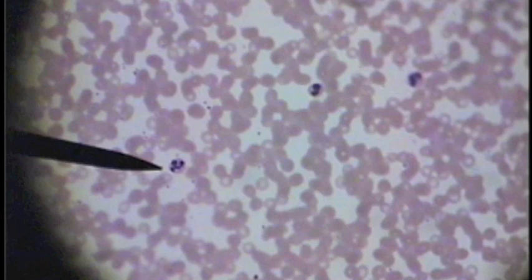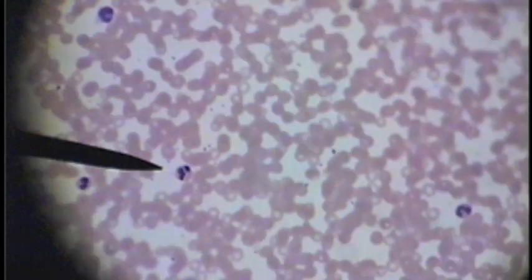You can also see three white blood cells that have been stained purple. The white blood cells' nuclei are the most prominent. The pointer is indicating a neutrophil — you can see three or perhaps four lobes to the nucleus.